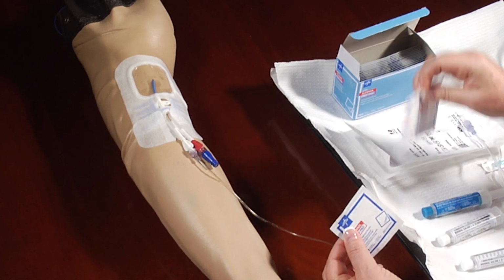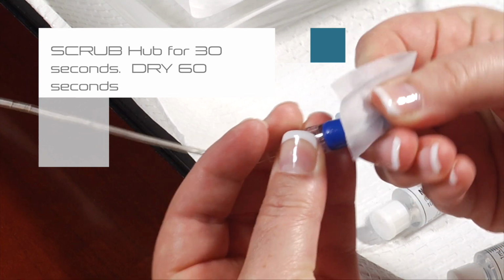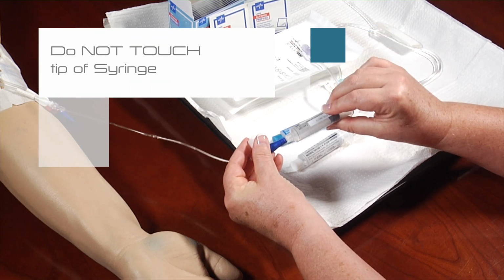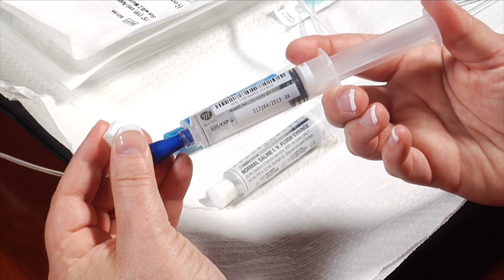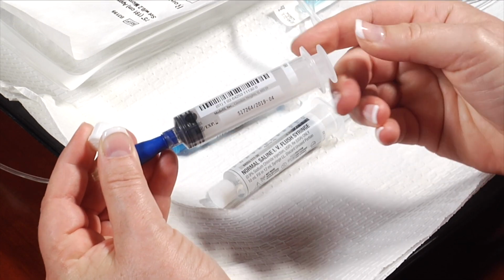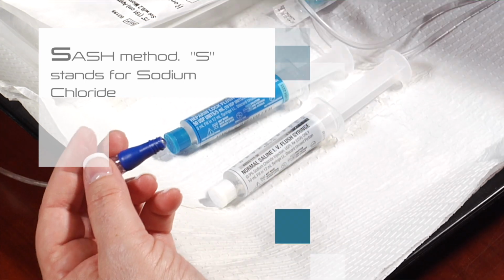Scrub the hub of your injection cap vigorously for 30 seconds with an antiseptic wipe, and allow to dry for 60 seconds. Attach the pre-filled syringe of sodium chloride to the end of your injection cap by pushing and turning clockwise to secure the syringe in place. Flush the catheter with a prescribed amount of sodium chloride as directed by your nurse using a push-pause method. Disconnect the syringe. SASH method. S stands for sodium chloride.